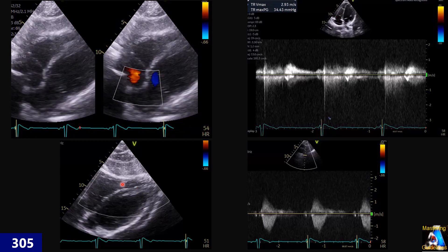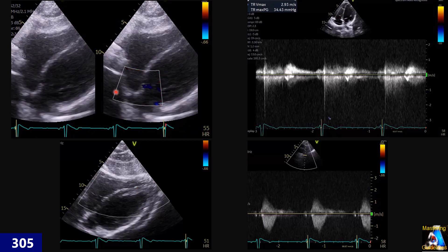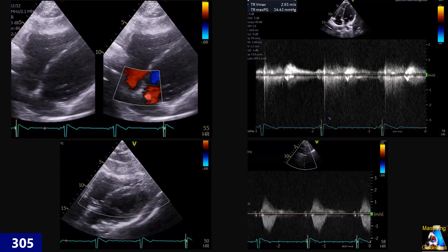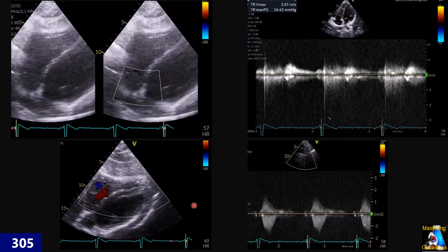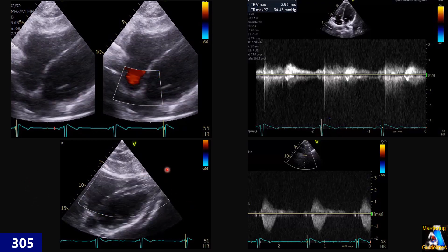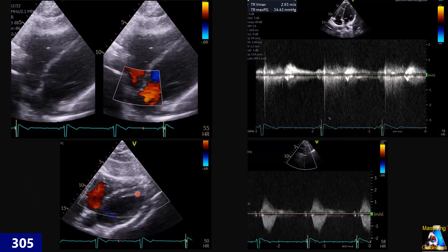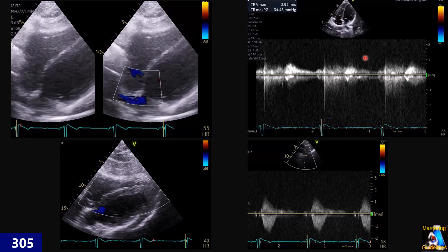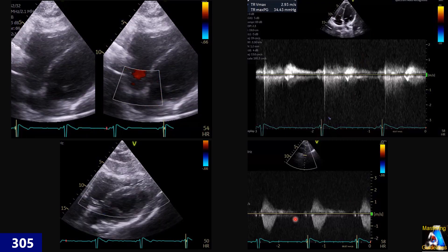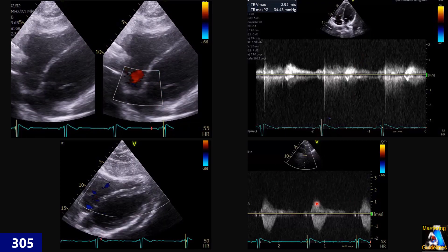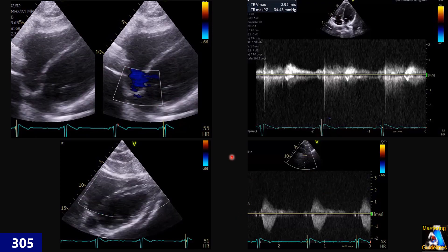Here we have subcostal views for PFO or ASD evaluation. Here another color view on the septum. And here TR and aortic continuous wave Doppler — that continuous wave is normal.